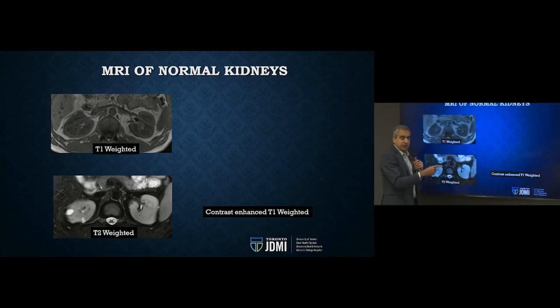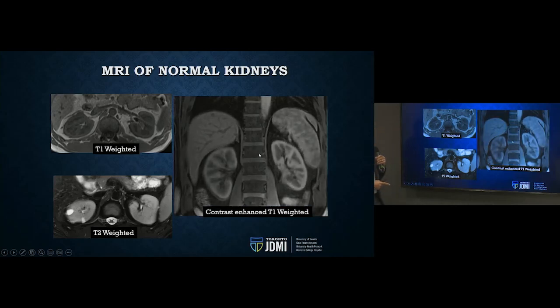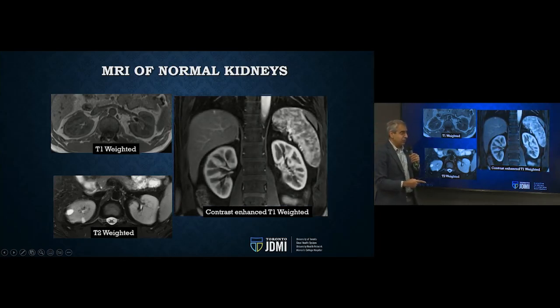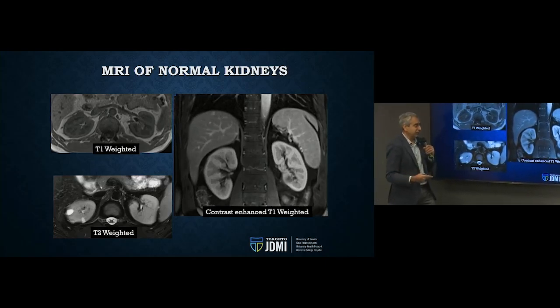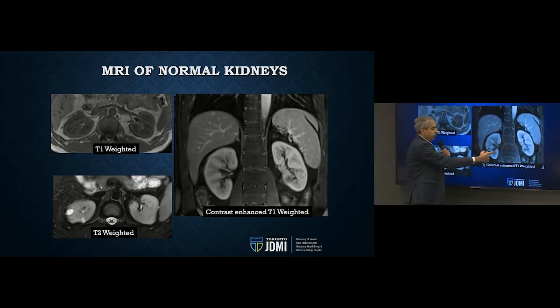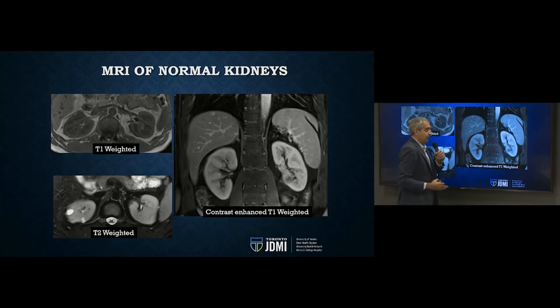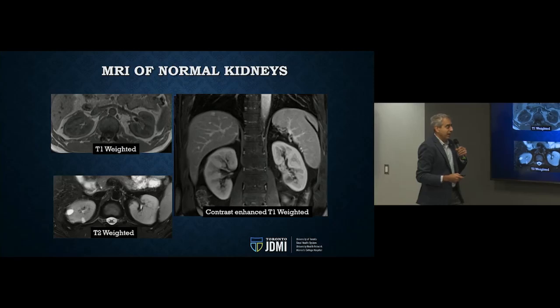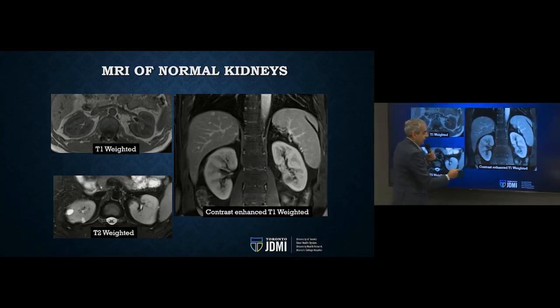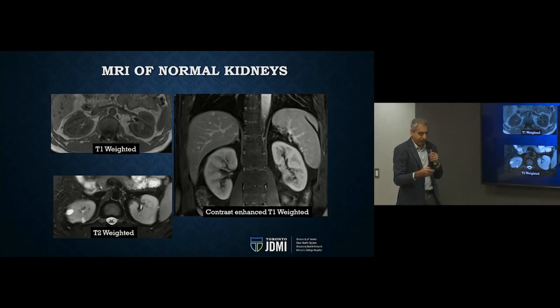And if you click on this image here, now we can see to some degree dynamically what happens when we inject the MR type contrast that you've heard this morning called gadolinium. And again, what happens is that the blood goes through the cortex and then starts working its way down into the medulla as the contrast starts getting into the collecting system. And so these are the different phases when we image them at different points in time.